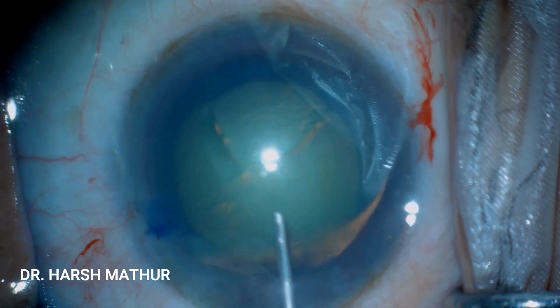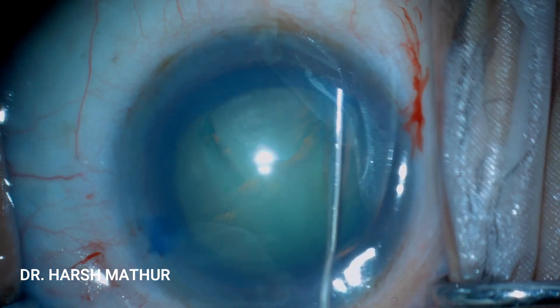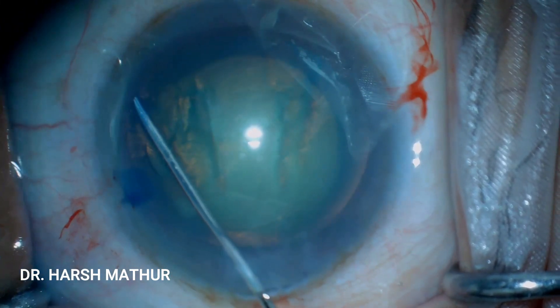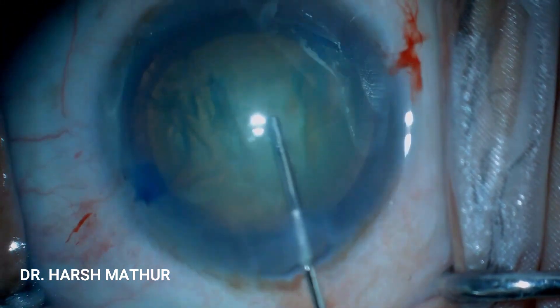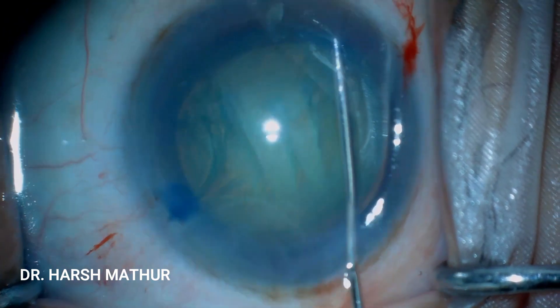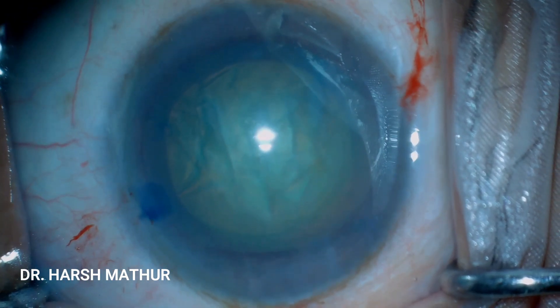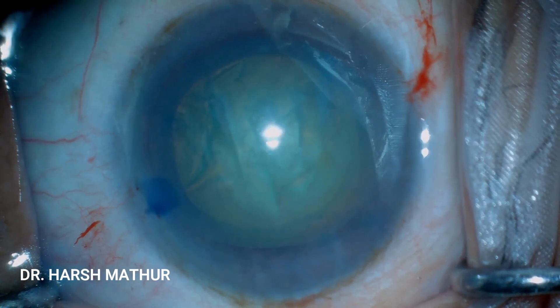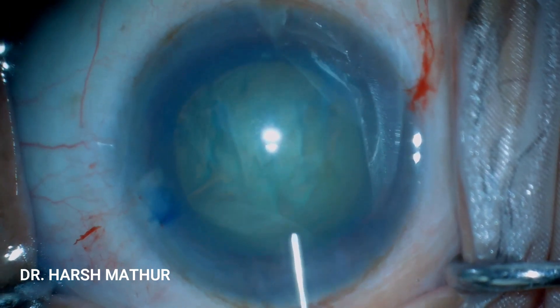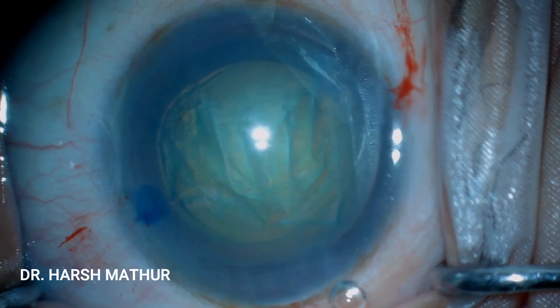Now is the time to do hydrodissection. Some amount of viscoelastic is burped out of the anterior chamber, and a small amount of fluid is placed between the lens and the capsule — just tenting the capsule a bit. Some more viscoelastic substance is injected.